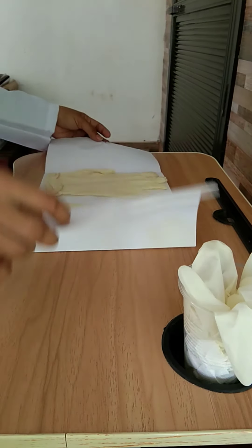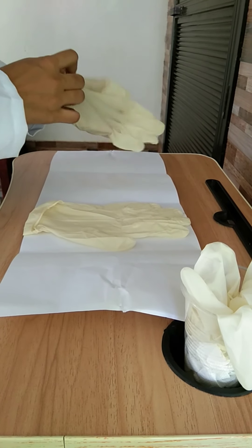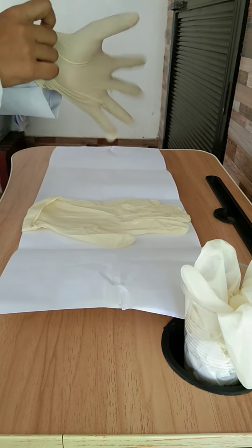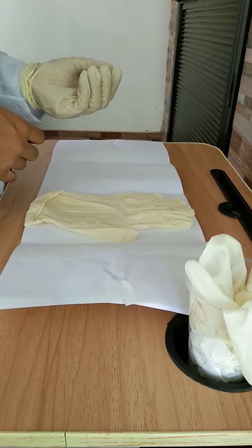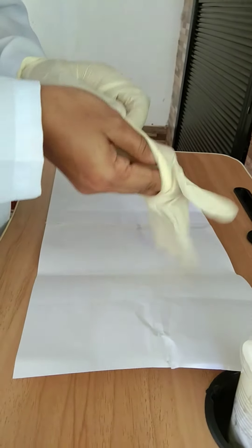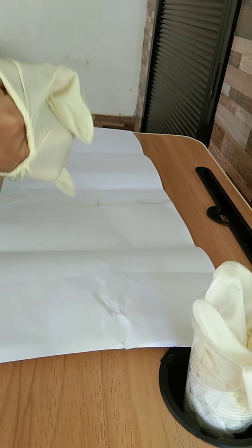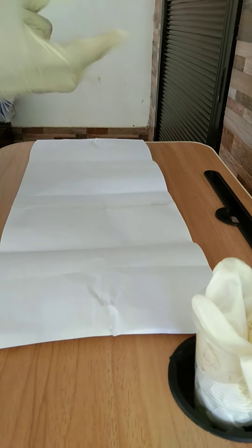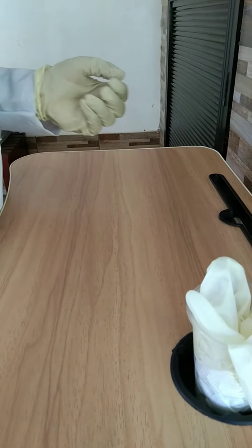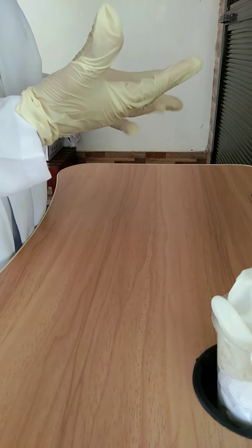Put one glove on your non-dominant hand. With your gloved hand, pick up the opposite glove by grasping the section that has a folded edge inside the cuff. Lift the glove up and away from the wrapper. Hold your hands above waist level and insert your dominant hand into the glove opening. Gently pull the glove into place with your non-dominant hand, touching only the inside of the cuff. Do not attempt to straighten the glove fingers until both gloves are on. Dispose of the wrapper, keeping your hands above waist level. Do not contaminate the sterile surfaces — you can touch sterile surfaces only with other sterile surfaces.